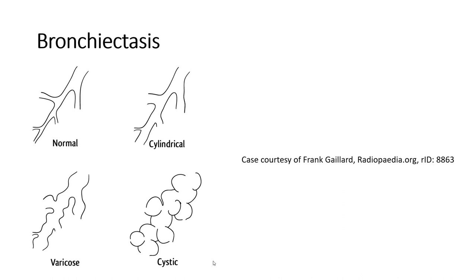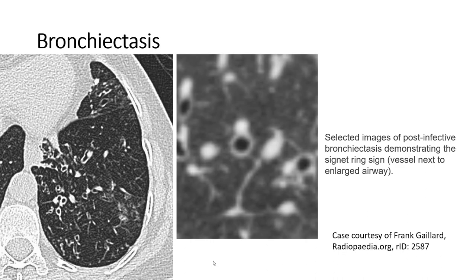There are several forms of bronchiectasis: cylindrical form, varicoid form, and cystic form. In this case of bronchiectasis on axial CT, we can see the classic signet ring sign, with the dilated bronchus adjacent to the accompanying vessel next to the enlarged airway.